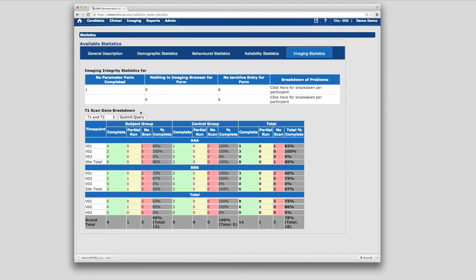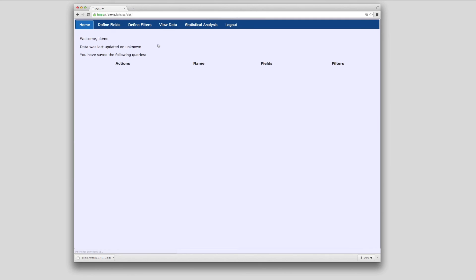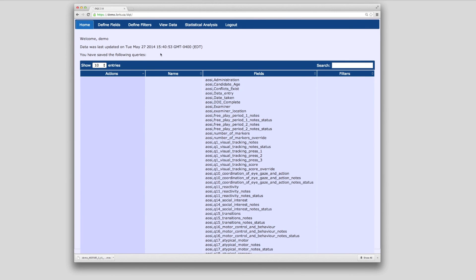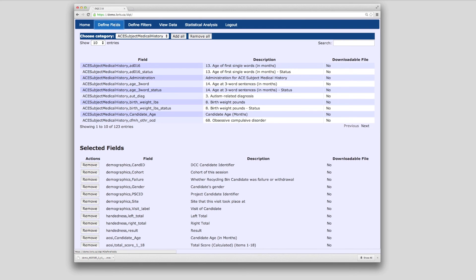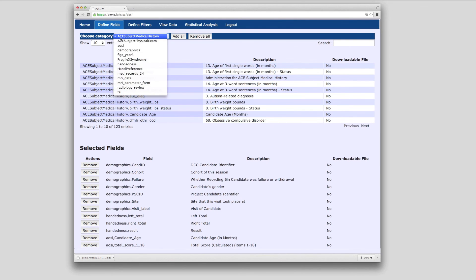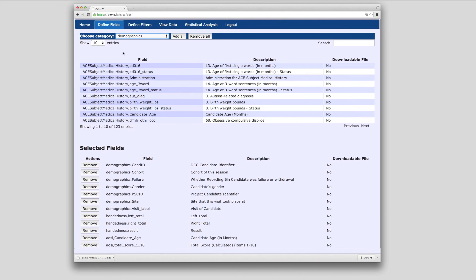The final module we will be covering in this video is the data querying tool, used for data extraction and dissemination. After the data has been collected, organized, and inserted into the database, downloading the data in an easily accessible and human-readable format is the final piece of the data management puzzle. As an example, we will load a query that has previously been saved inside the querying tool. Under the Define Fields tab, you can add or remove any fields from your query.